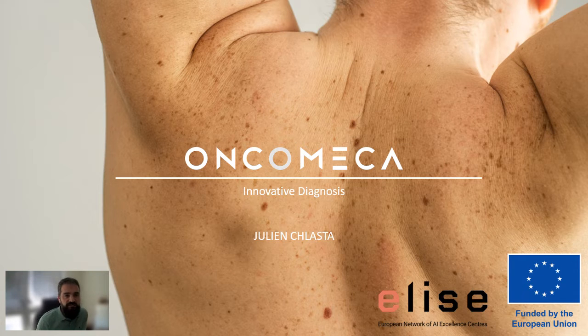The main objective of the Oncomeca project is to develop a medical device allowing a rapid and early diagnosis of skin cancer. This tool will provide support for decision making to general practitioners and occupational health physicians. This medical device relies on the use of the biomechanical properties of tissues for diagnosis purposes, through the identification of new markers, like mechanomarkers in this case, which will enable us to characterize and classify the lesion.